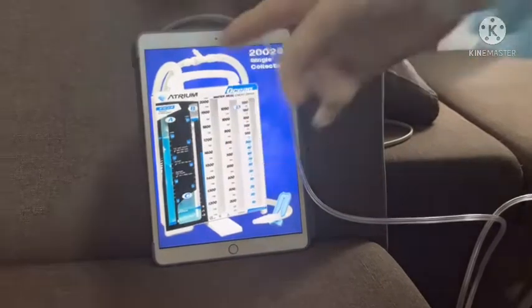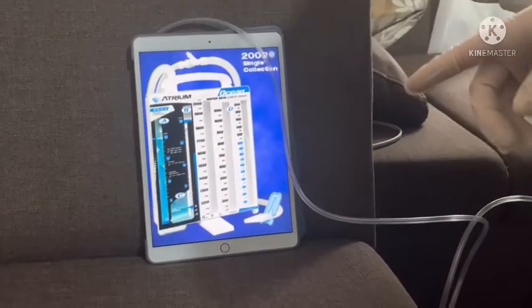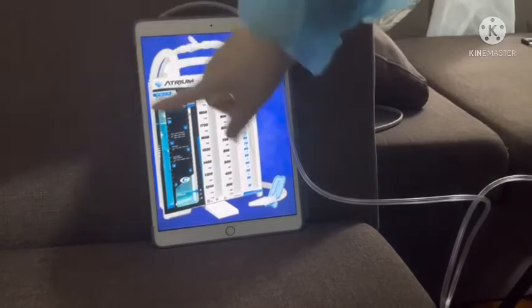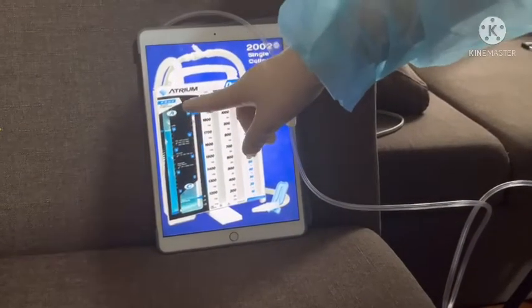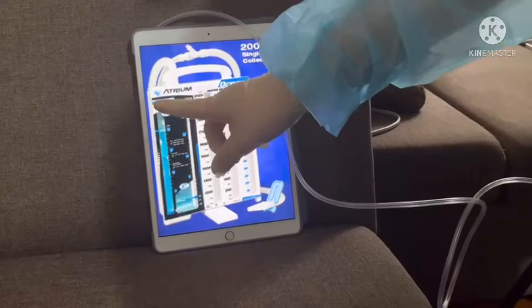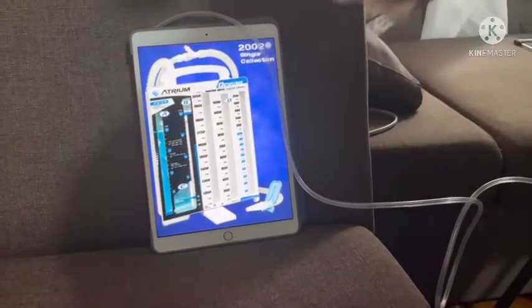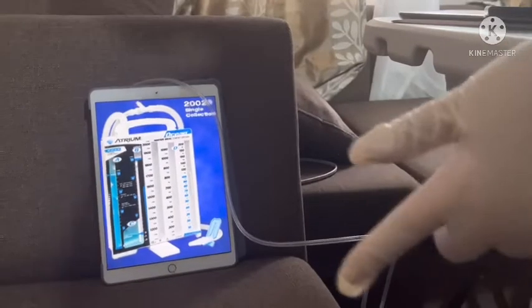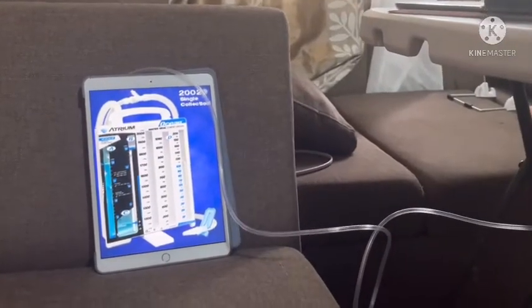When I reconnect the tube that I removed, the bellow will reappear. So the pressure is done by the physician's order only.